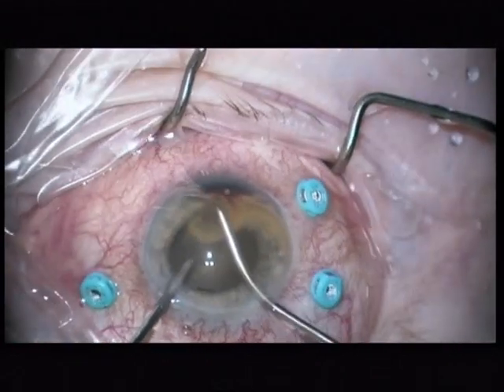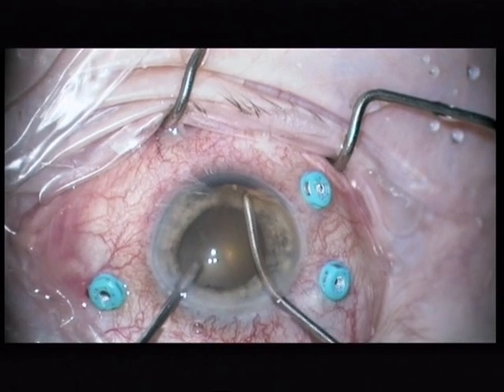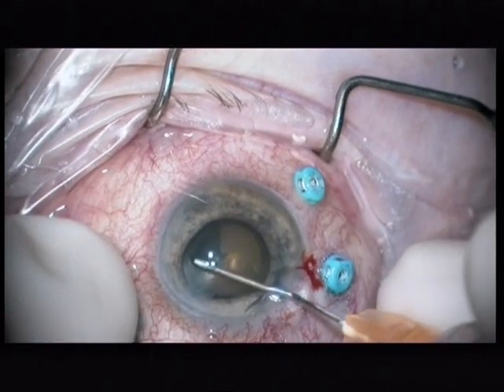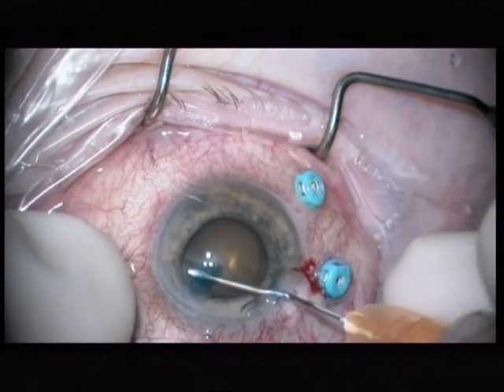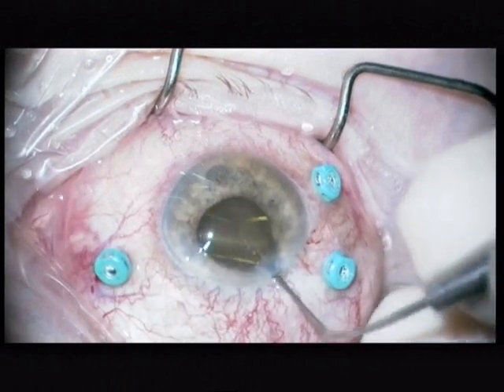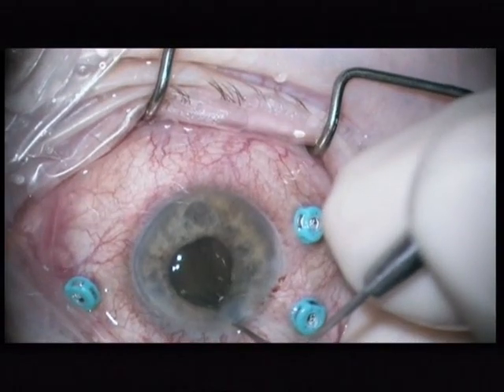Starting now with an irrigation aspiration to remove the blood. Then the next step is phaco emulsification. Of course you need vision blue, because there is no red reflex. Then implementation of a one-piece IOL.